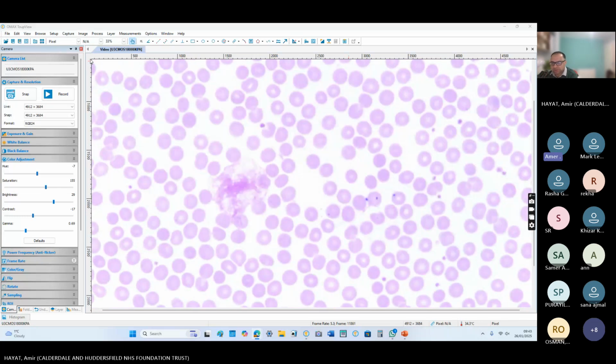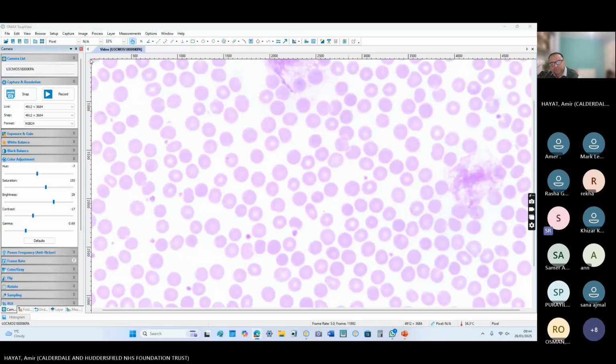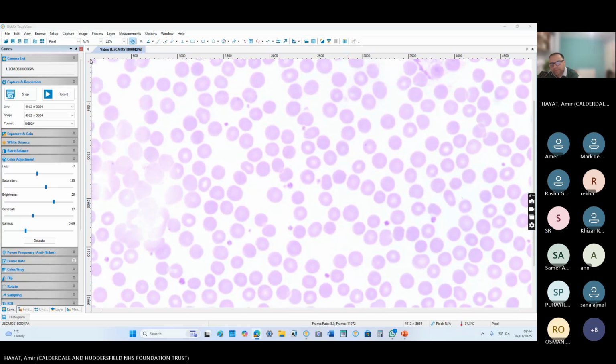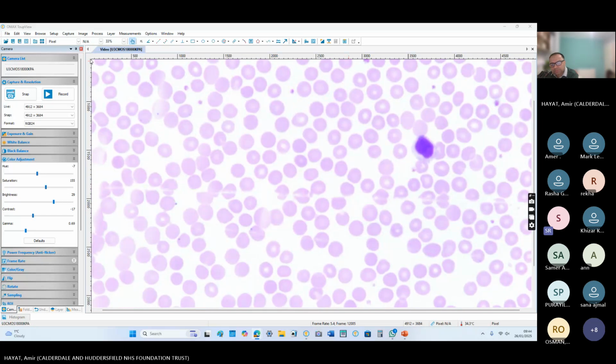Which lymphoma were you thinking that this patient has? As you said, large granular lymphocytes, maybe I'm thinking there is LPD, lymphoproliferative disorder. Which one? So, large granular lymphocytes, because these are large in size and quite a few are granular as well. But there is scalloping. Okay. So if in the exam you get an LGL lymphoma, they will give you a history of neutropenia and a history of autoimmune disease.